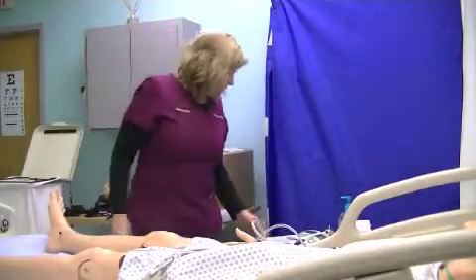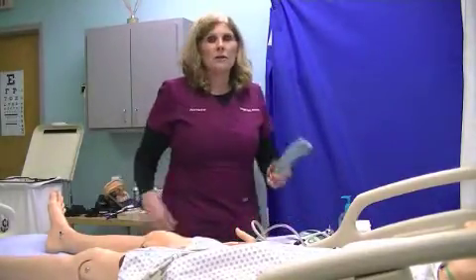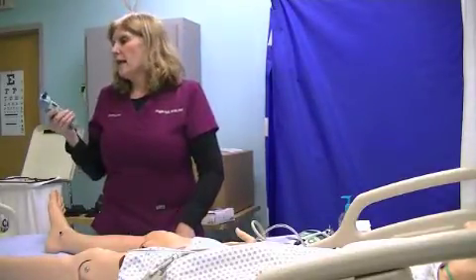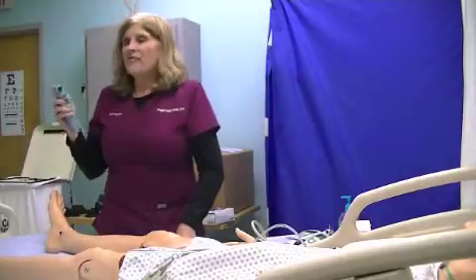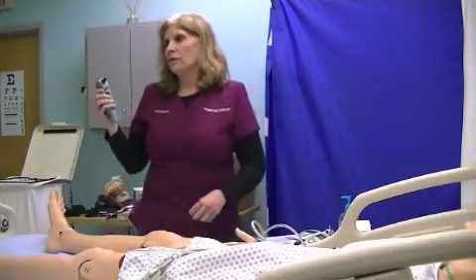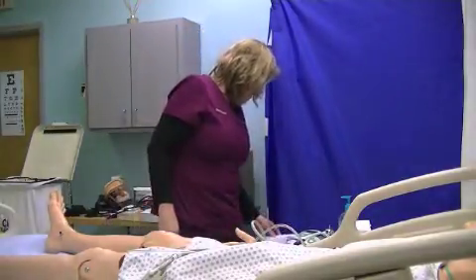If I'm going to do a tympanic temperature, that is a thermometer that's placed in the ear, and it reads the core temperature off the tympanic membrane. If I have impacted earwax or a hearing aid device, it won't read the core temperature correctly. So we want to make sure that's not the good choice for them.